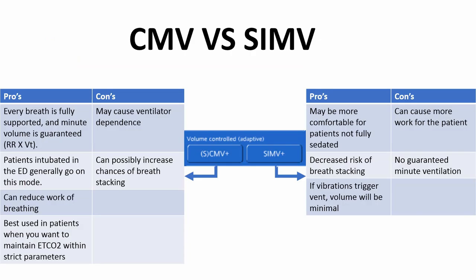There are pros and cons of each. Whether or not somebody prefers CMV or SIMV probably depends on who taught them ventilator management. It's really subjective. Some people prefer CMV, some prefer SIMV. The pros to CMV is that every single breath is fully supported. So you guarantee a certain minute volume. Your minute volume is your respiratory rate times your tidal volume.